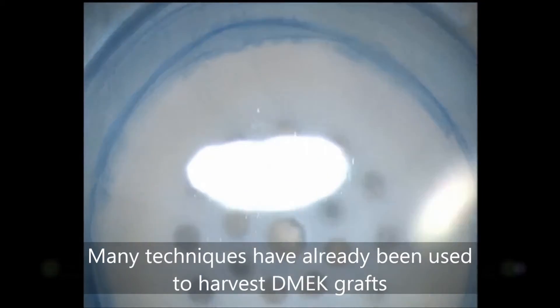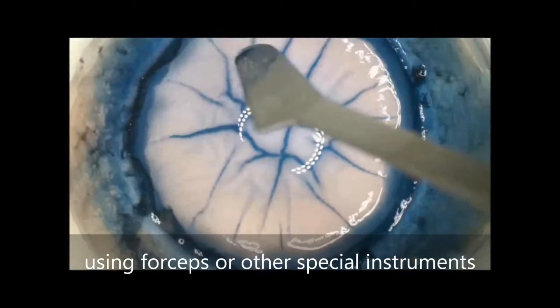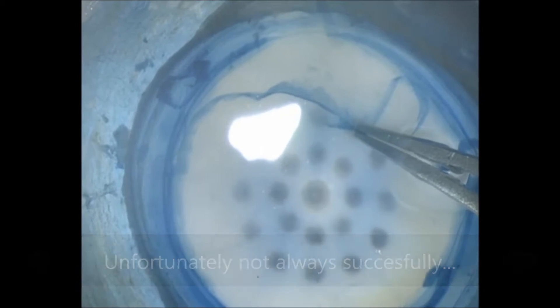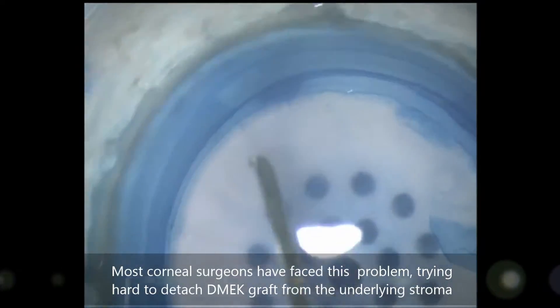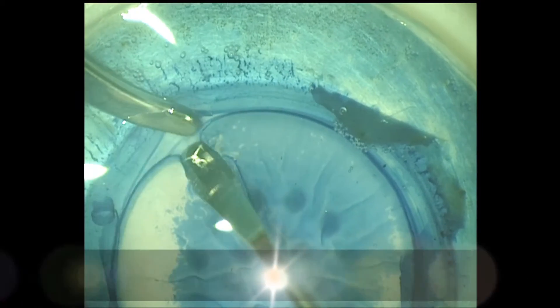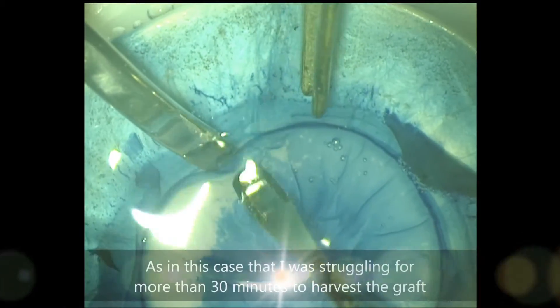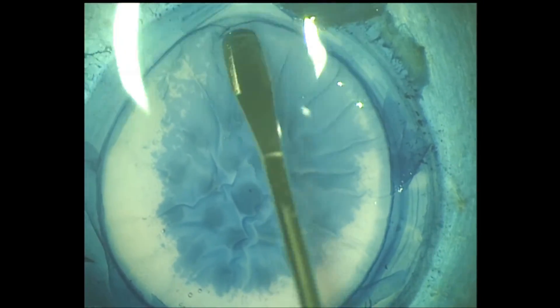Many techniques have already been used to harvest DMEK grafts using forceps or other special instruments — unfortunately, not always successfully. Most corneal surgeons have faced this problem, trying hard to detach the DMEK graft from the underlying stroma until it starts to seem like a mission impossible, as in this case where I was struggling for more than 30 minutes to harvest the graft — not successfully.